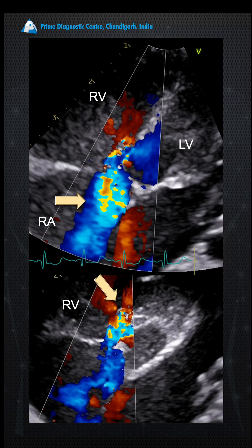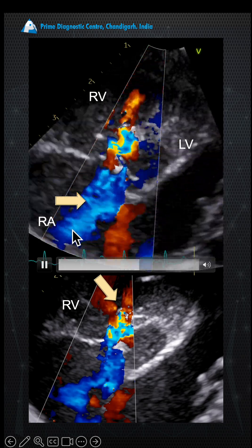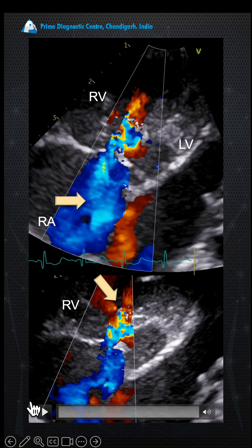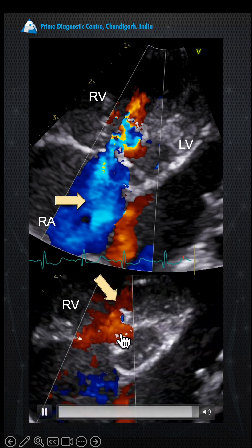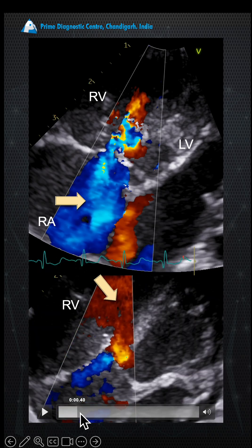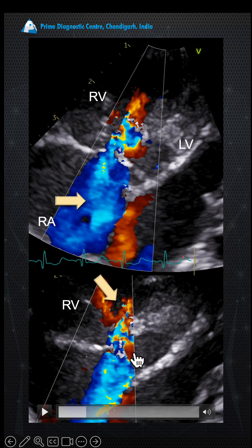Here you see the tricuspid regurgitation which is moderate to severe. In the lower panel you see something interesting — when I zoom into this area, you can see there are three or four jets coming from this region. So what is this? This is the interatrial septum — interventricular septal aneurysm — which is trying to close a ventricular septal defect.